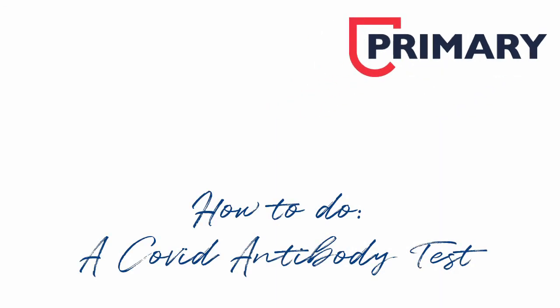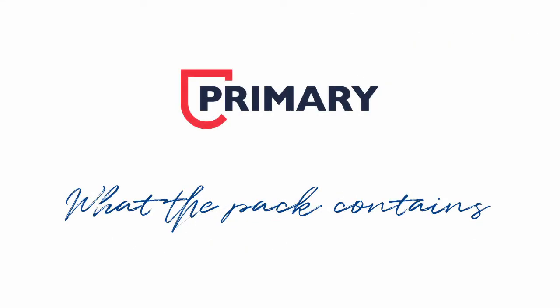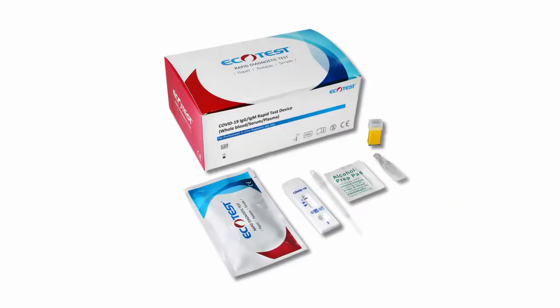How to do a COVID antibody test. What the pack contains: your pack contains a small pipette, an alcohol wipe, a solvent solution, and the COVID test device.